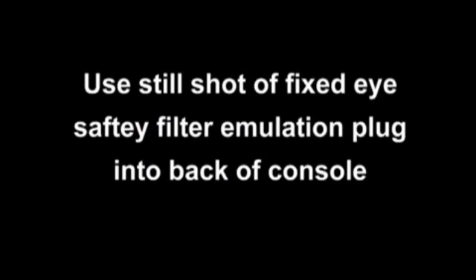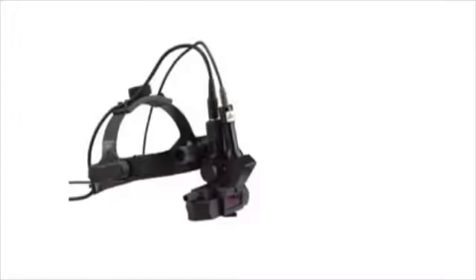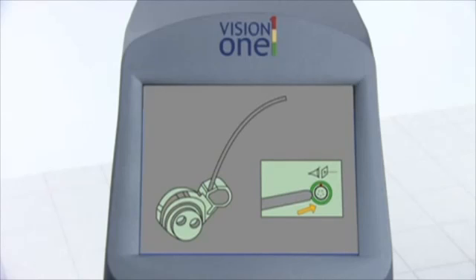If you are using only a fixed eye safety filter, then you must insert the emulation plug into the eye safety filter receptacle. The LIO delivery device has an integrated eye safety filter. When the LIO is the selected delivery device, you need not insert the emulation plug into the eye safety filter receptacle. If no plug is inserted into the eye safety filter receptacle, or if the plug is incorrectly inserted, a message displays on the control screen until a plug is properly inserted.